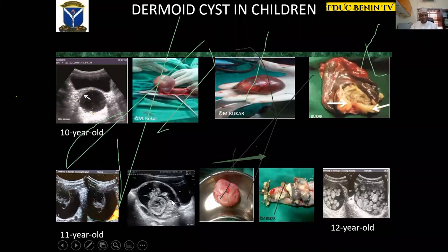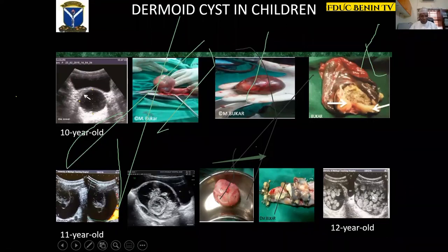Somewhere here you can see a dot-dash pattern meshed within a less echogenic area — this is fat with hair. You can see the follicles, ovarian tissue, and between the follicle and the cyst a halo, suggesting it would be easy to tease out this ovary at surgery. This is called a dermoid ball — it is a rare ultrasound manifestation of dermoid cysts and is pathognomonic of dermoid cysts.